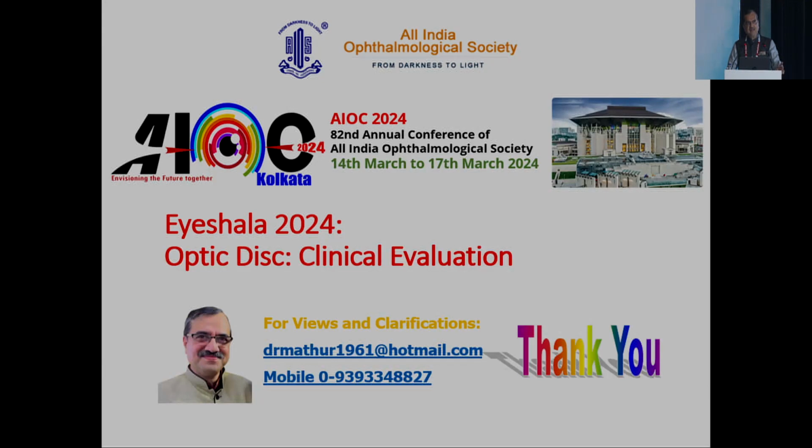So whenever you are sitting in your OPD, what is the first thing? In institutes, the patient gets a visual acuity, patient gets an NCT, then the patient comes to you. NCT, though, the moment, when do you suspect glaucoma? That is when you make a habit: don't see the disc in your routine with your direct ophthalmoscope. Always make a habit, have a 90 diopter lens with which you can definitely see the disc, even in an undilated pupil if you want. First thing that you look at is the disc.